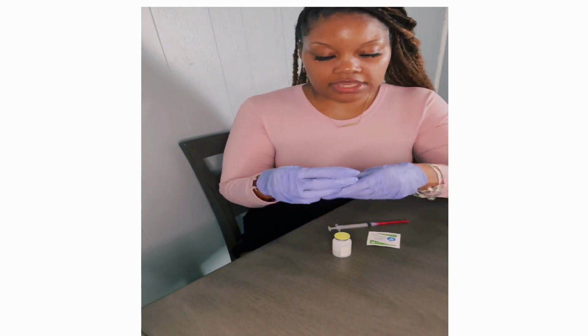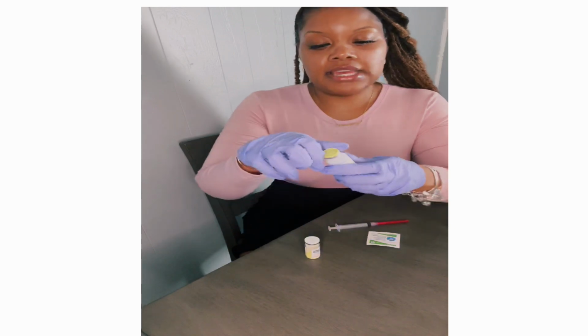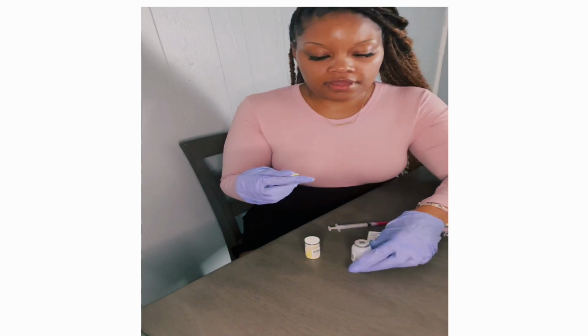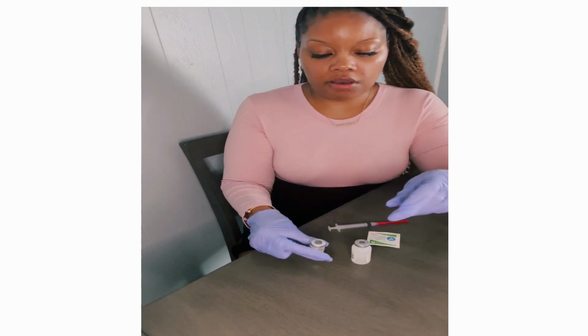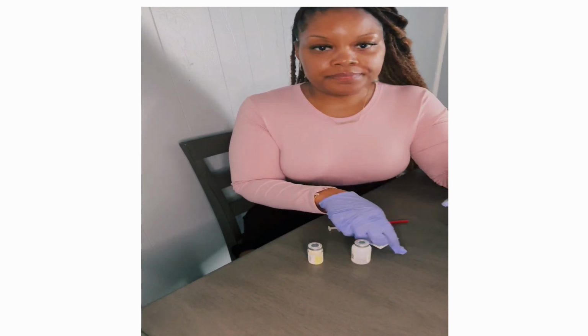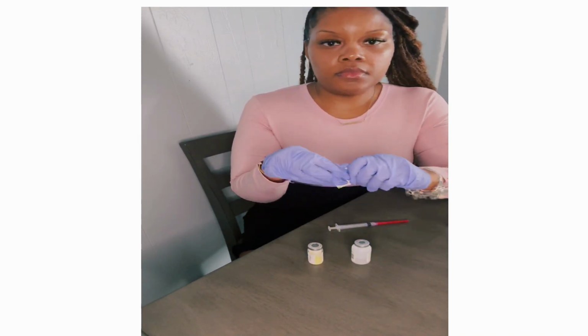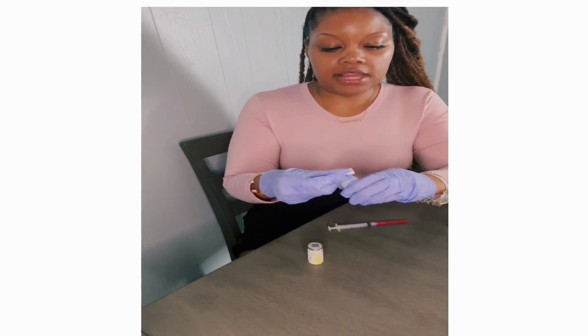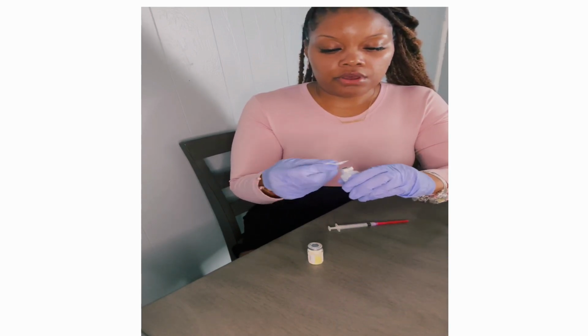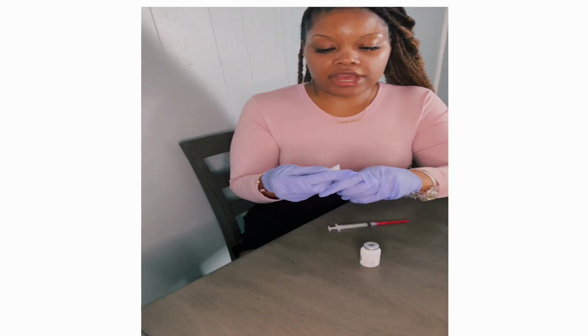All right, so then I'm going to go ahead and take the cap off of my water, and then I'm going to take the cap off of my medication. So you can just go ahead and clean your hub on both and let it dry.